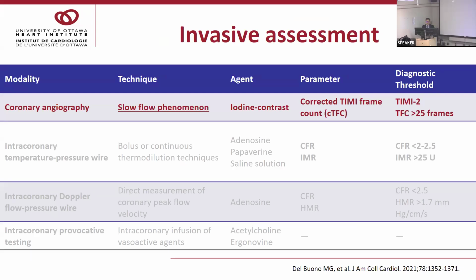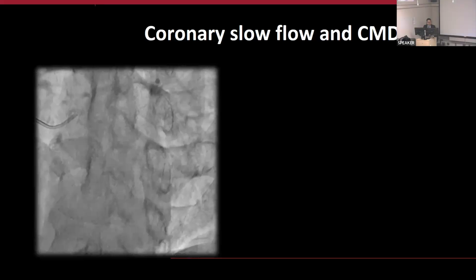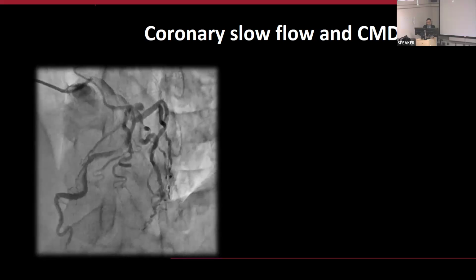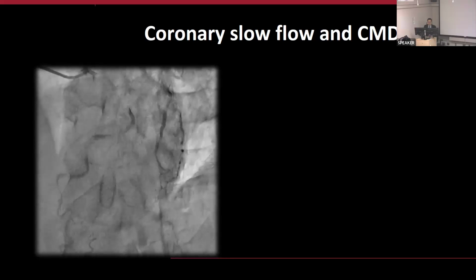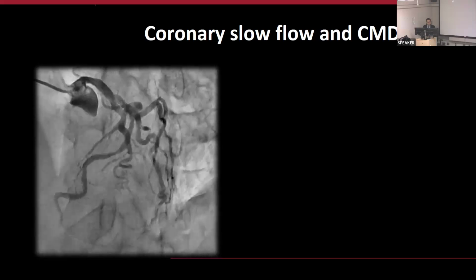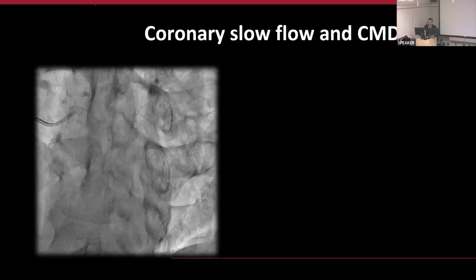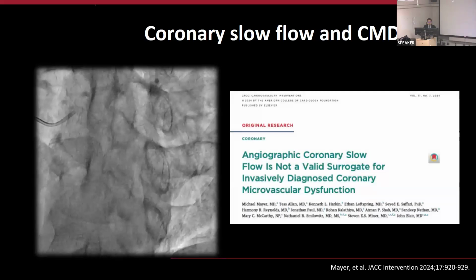Invasive assessment is essentially based on invasive coronary angiography. Some people argue that the coronary slow flow phenomenon may be a surrogate for CMD, particularly in the setting of non-obstructive CAD. This is a video showing the coronary slow flow phenomenon. This is my own case back in Japan. The velocity of the contrast is relatively slow, and the washout is also delayed. However, it should be noted that a recent article questions the association between CMD and coronary slow flow. So I think this should be further evaluated.